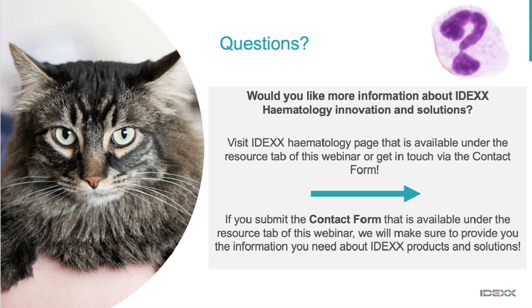Yeah, that is a great question, because I see a lot of practices that do most of their in-clinic hematology on their sick patients where they want the results right now, but they take advantage of the money savings for the customer by sending a wellness patient to the reference lab. So they use both in-clinic and reference lab. I think both are obviously valid ways to look at it. But from my perspective, I strongly recommend using the same analyzer as much as I possibly can.